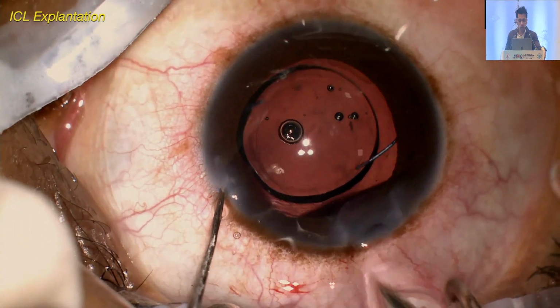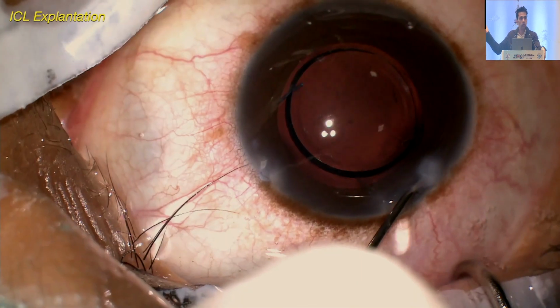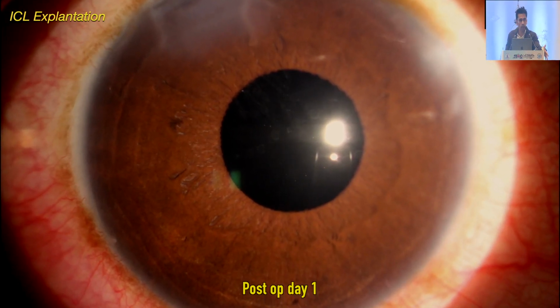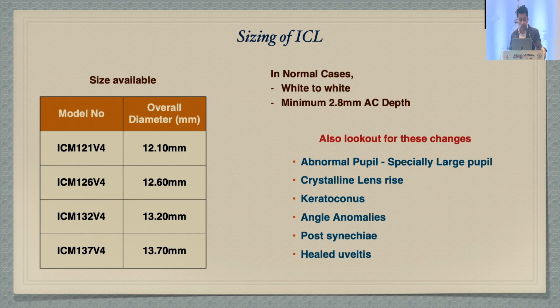I'm just showing you in these cases the cataract procedure as well, because the requirement over here was a cataract procedure for us to remove or explant, and the post-op day looks good. You don't have to really worry too much about that. The effect of the central flow is that you really reduce the risk of angle closure and reduce the risk of cataract formation.